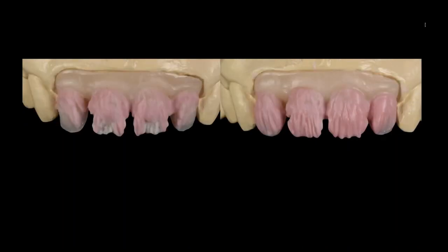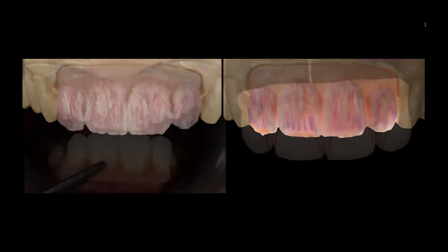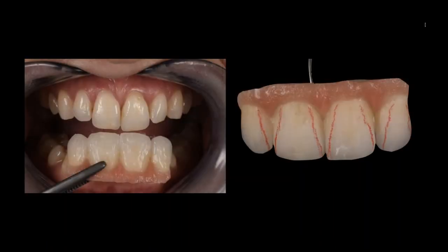Then I'll start with my dentins and I'll go through my normal buildups and that stuff becomes fairly simple. I'm not layering tons of powders anymore on them. I'll use some translucency and some effects, and that's after one fire. So that's out of the oven. Those are the teeth that we use as kind of a reference point. So we did this in one fire in London, actually, a month or two ago.